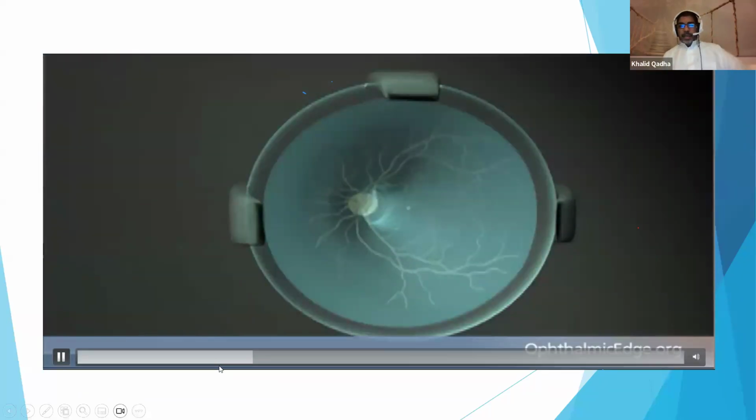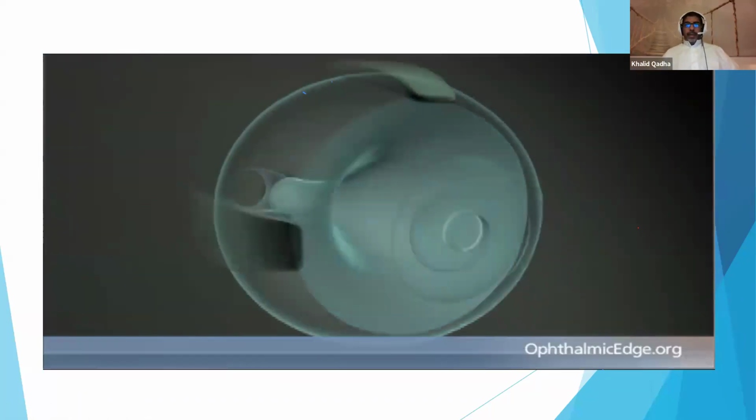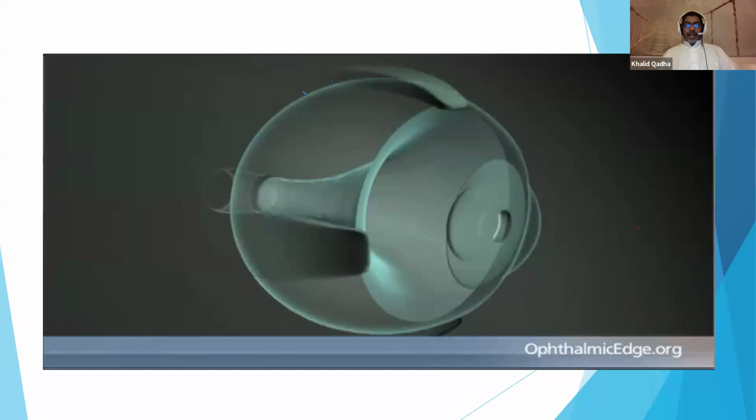So as you see here in this picture, it looks, as I said earlier, like an open retinal detachment. But once we start the image, this is how it looks inside the eye. Let's wait for the probe to start.